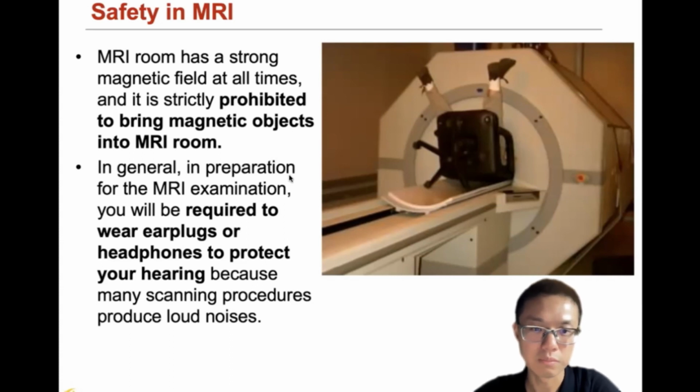And in general, in preparation for the MRI examination, the patient will be required to wear earplugs or headphones to protect the hearing, because as we saw in the last video, the MR machine makes very loud noise. This may cause some damage to the hearing, so we need to have some protection for the ear. These are some of the safety protocols in MRI.